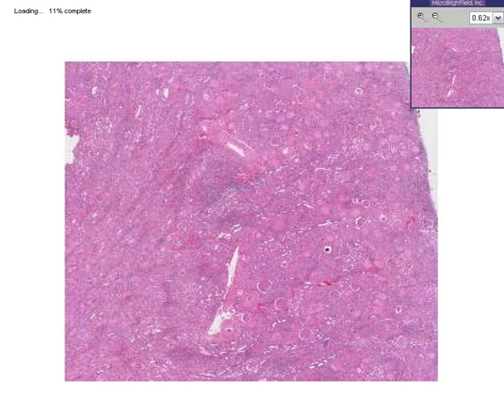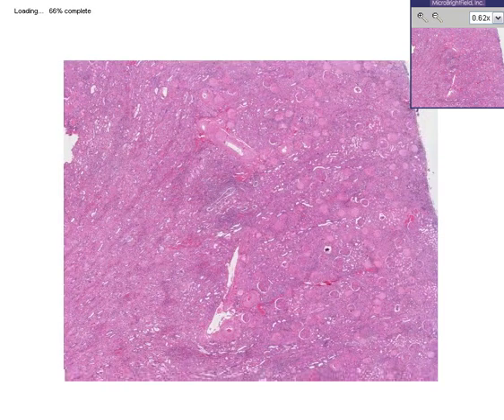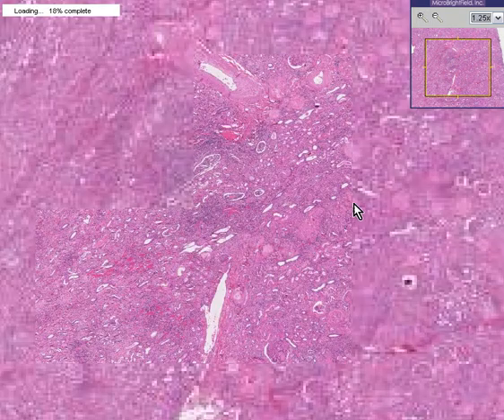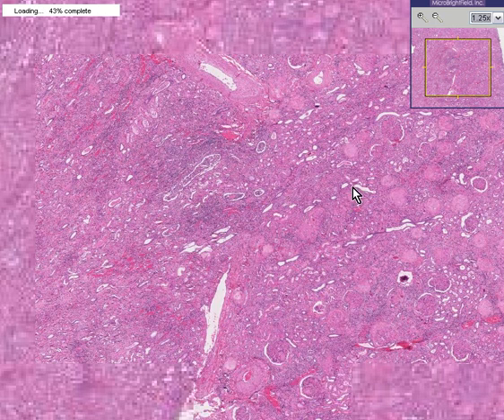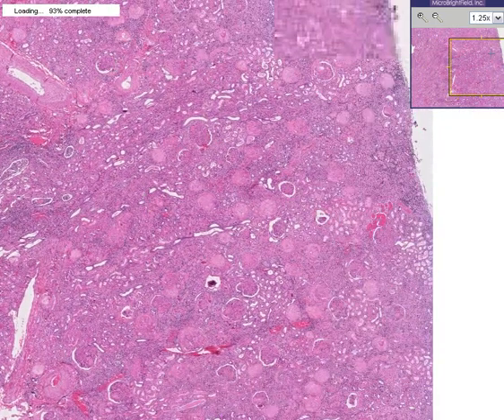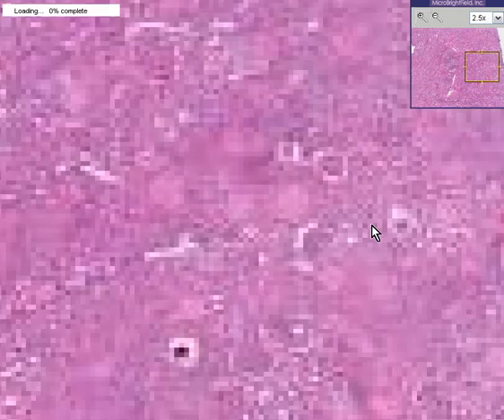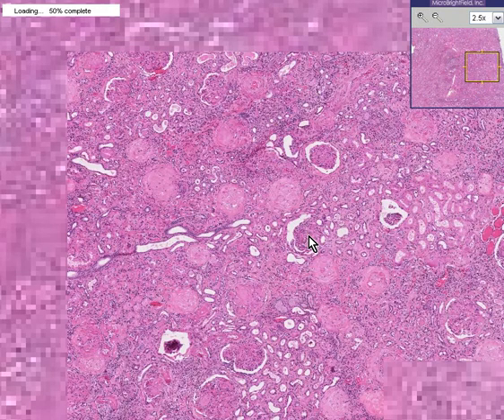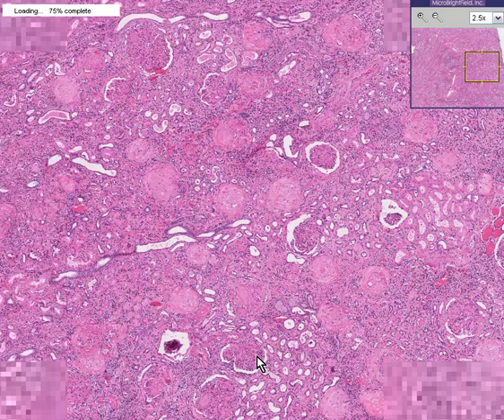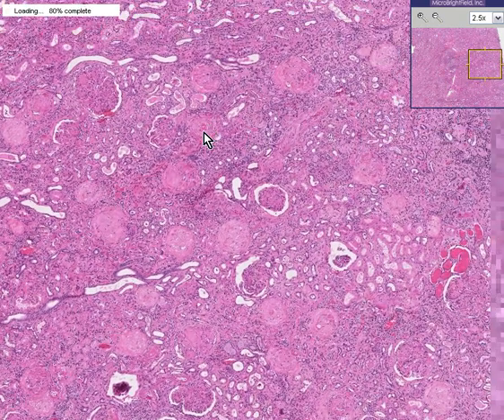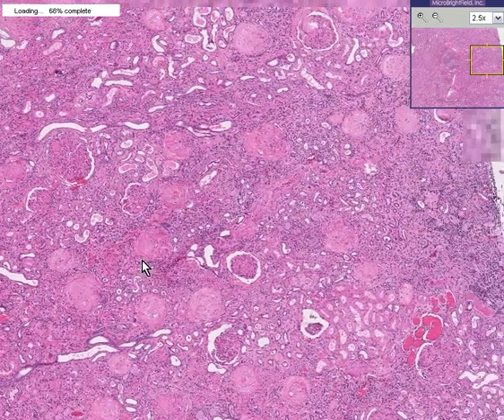Here is a cut microscopic section through that same kidney. You could recognize this instantly as being a kidney because you can see a whole bunch of glomeruli. Some of these appear to be fairly normal glomeruli within the cortex.